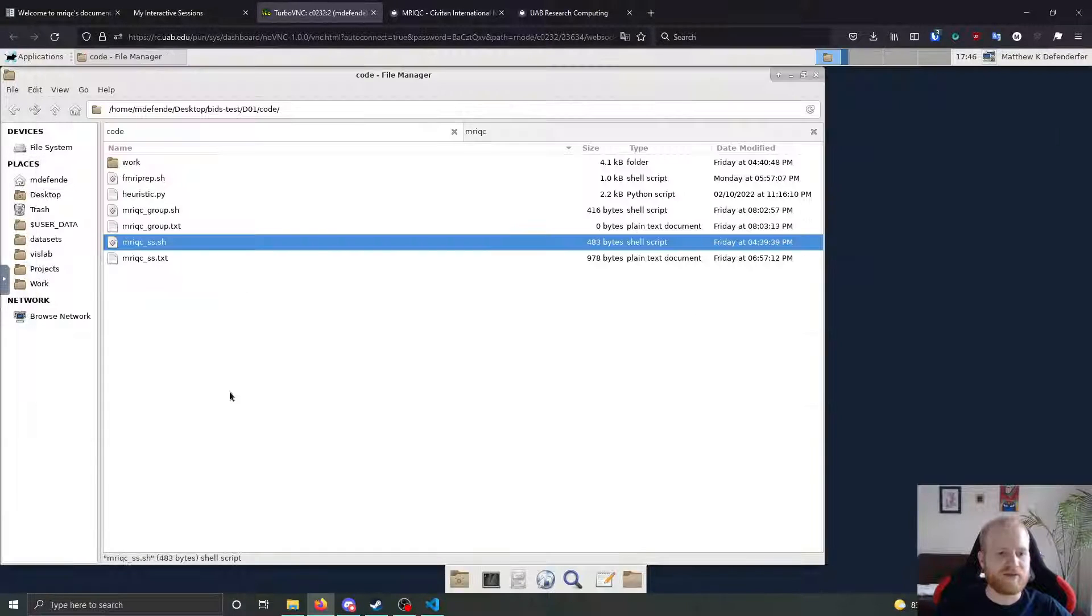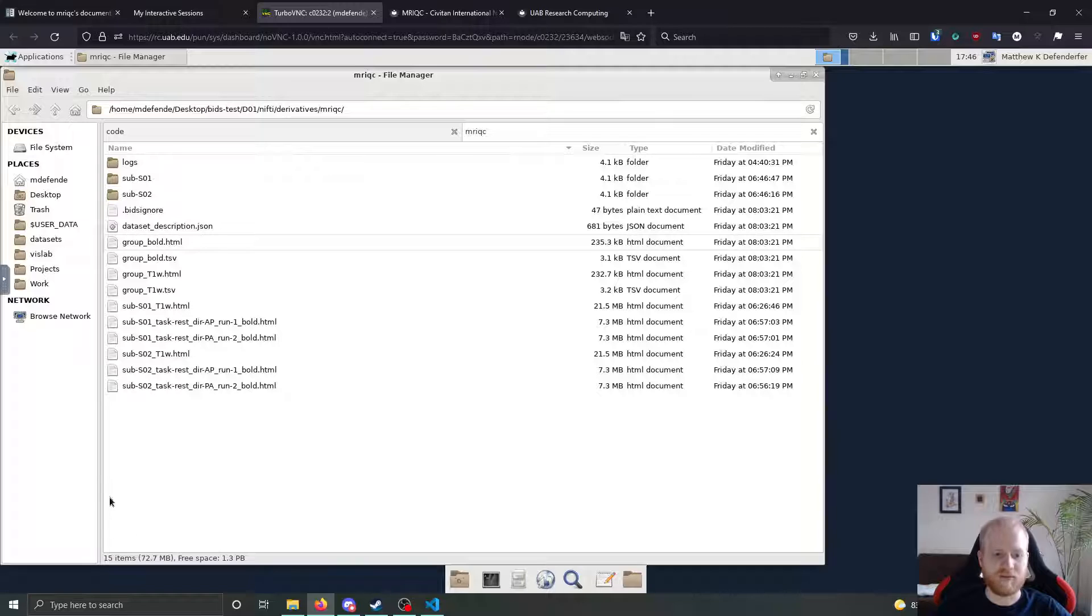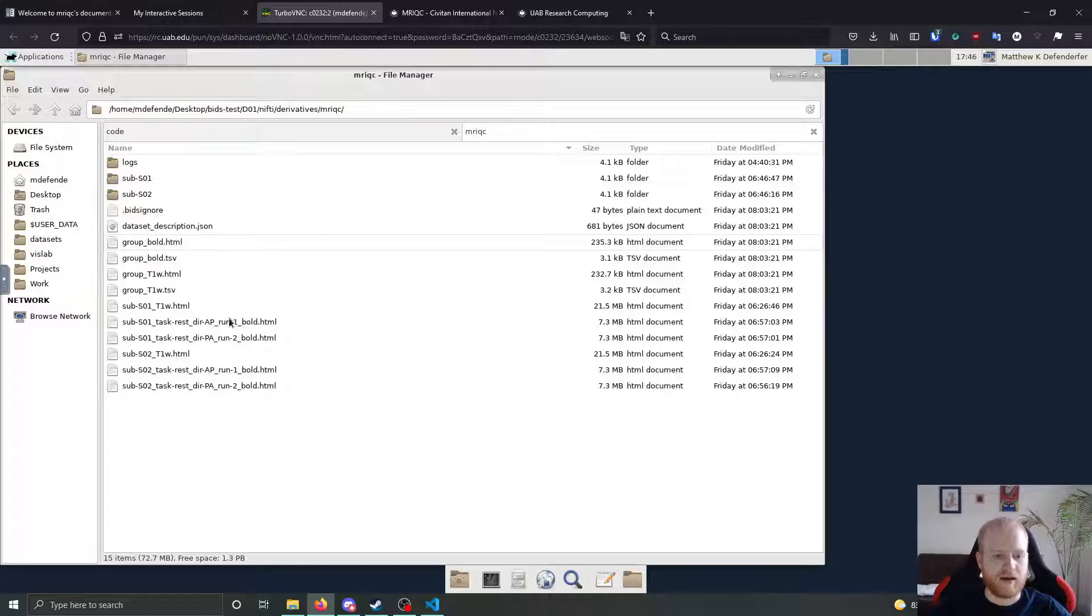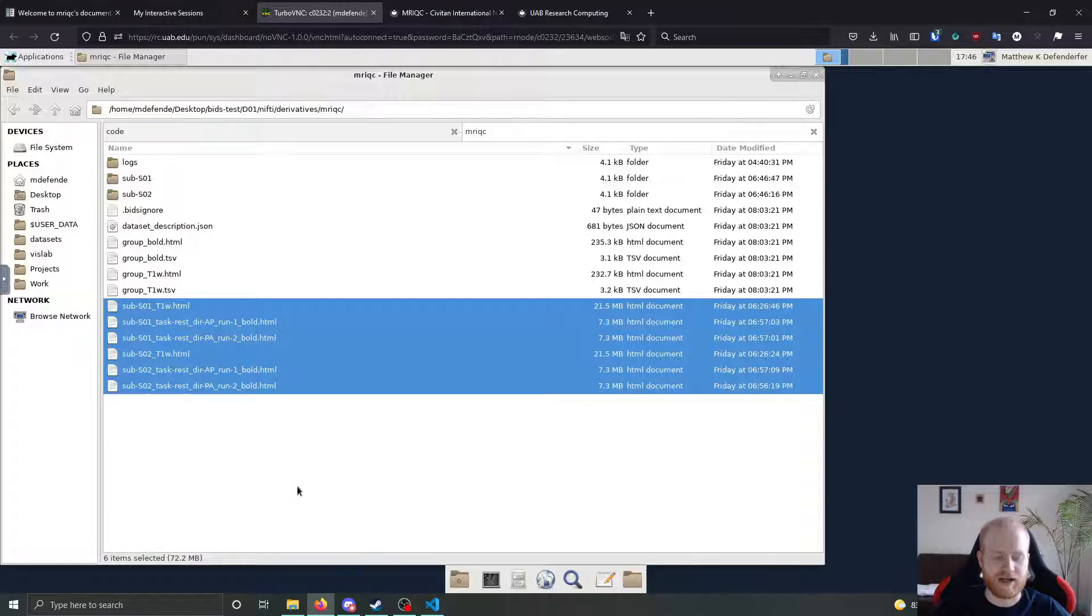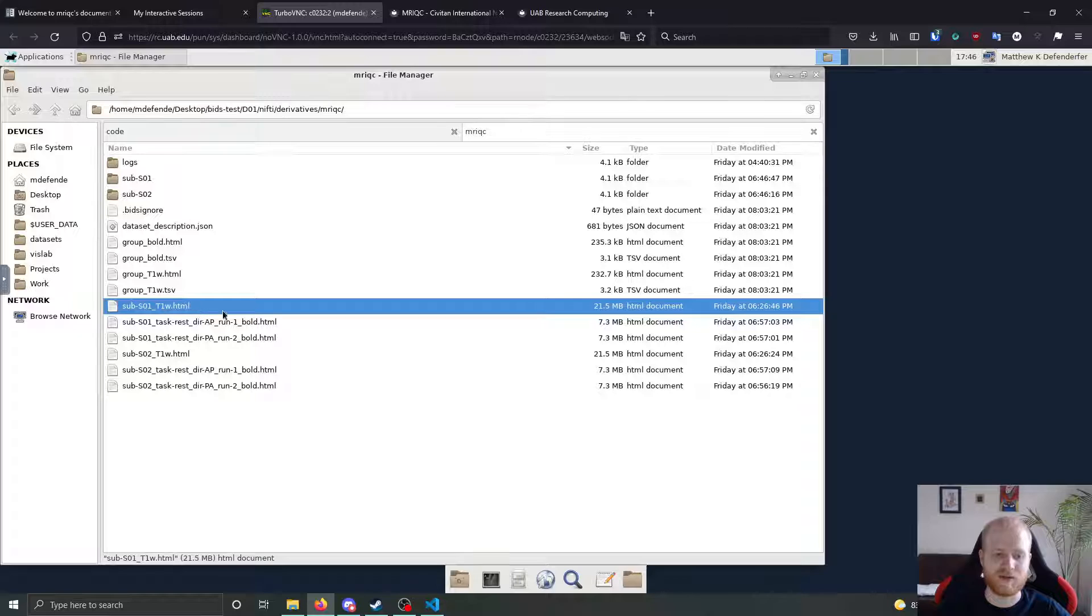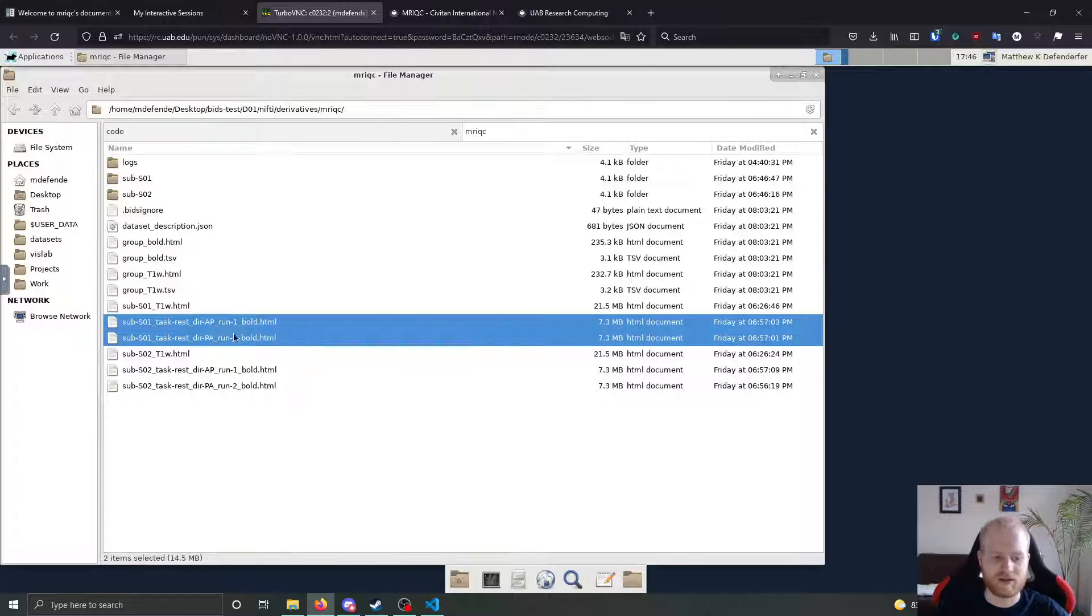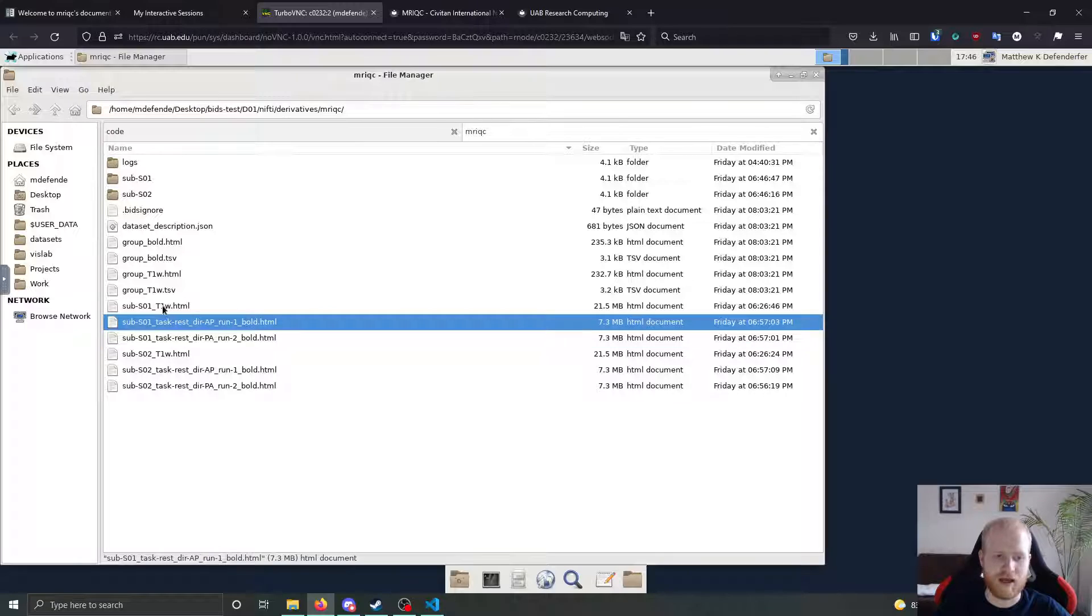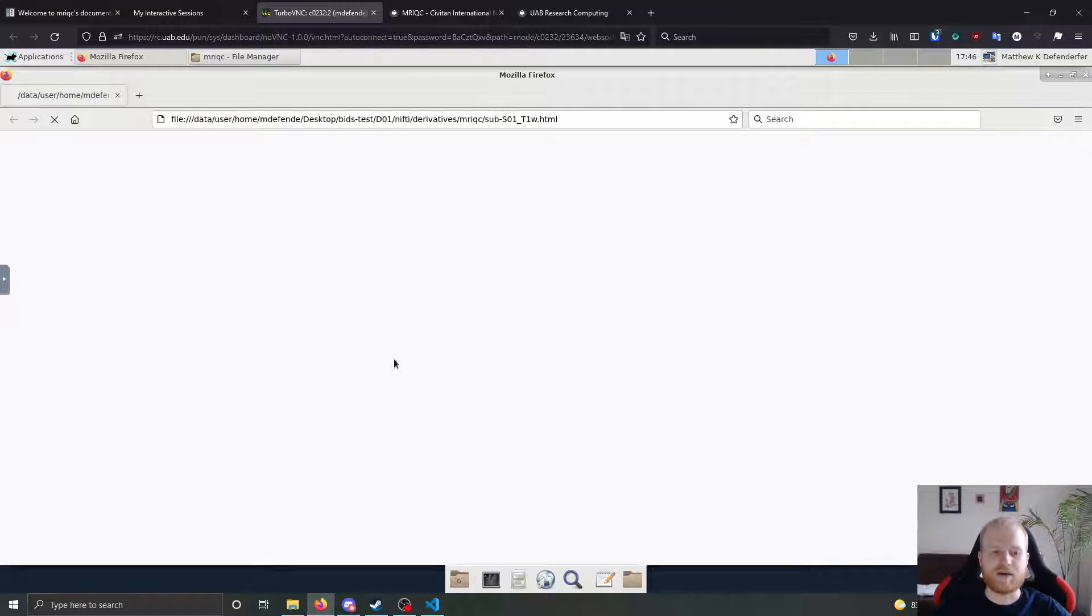So after we run that, if we go and look at the outputs, we're in our nifty derivatives folder, MRI QC, and it outputs a series of scans for each structural scan and functional scan. So for our participants, we have one T1 weighted image and two functional images. So we have an individual HTML file for each of those.